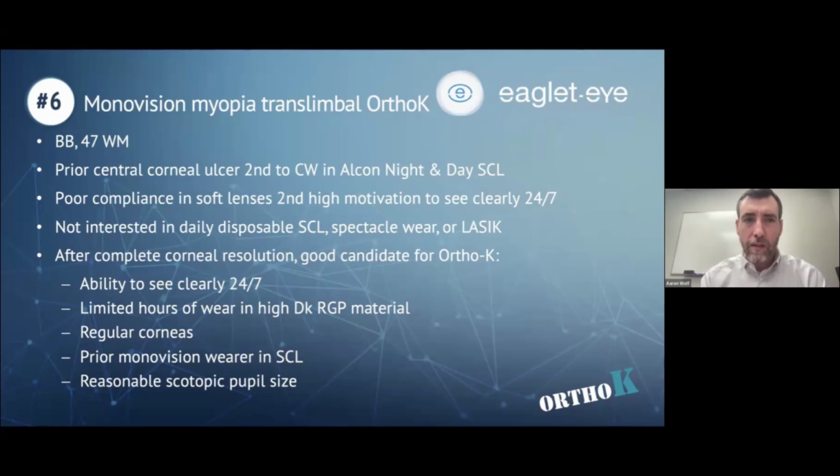So with adults, this is a particular point of interest. When you're doing orthokeratology, most orthokeratology worldwide is really geared towards adolescents and myopia management, in which the pupil size is not generally a great concern. Sometimes larger pupil sizes can be beneficial. With adults, that can be a little bit riskier, and so being able to navigate around that is helpful to achieve the greatest nighttime driving vision possible.